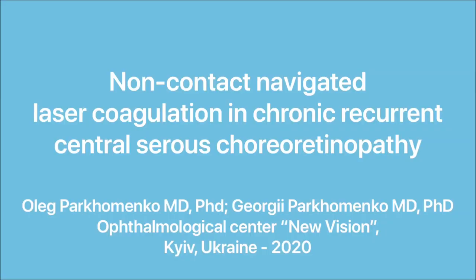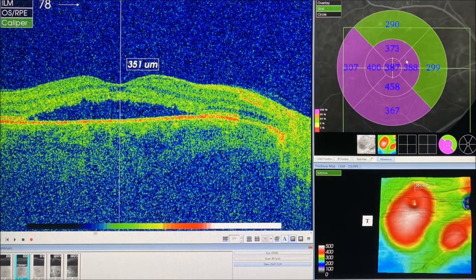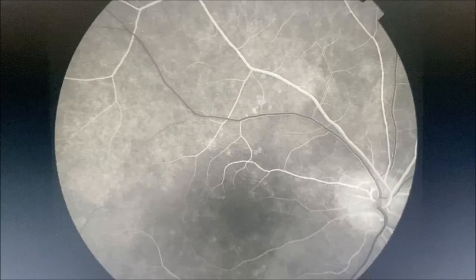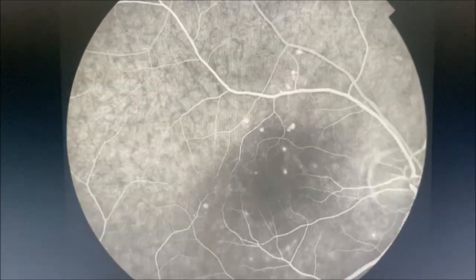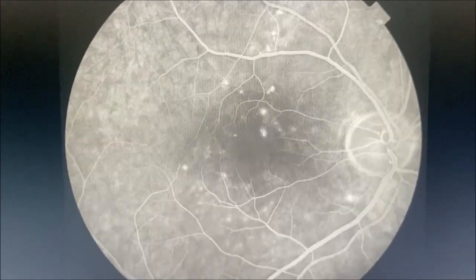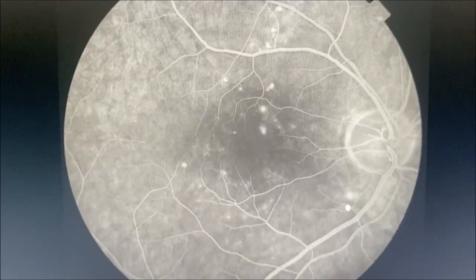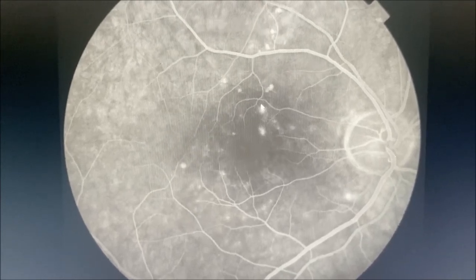Non-contact navigated laser coagulation in chronic recurrent central serous chorioretinopathy. Two areas of subretinal fluid were evident on OCT. On fluorescein angiography, three points of leakage were revealed and are marked with a pointer.